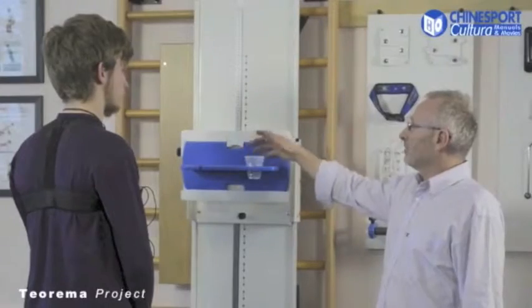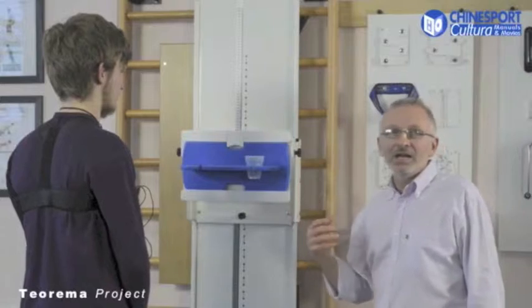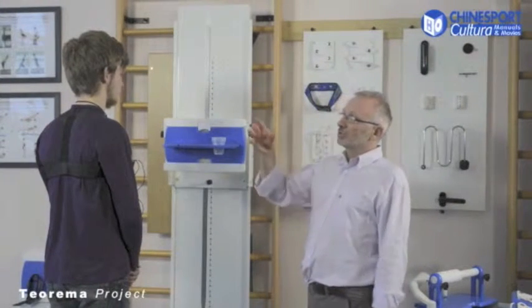What we would like to insist on and focus attention on in relation to the therapist's role is paying more attention to the manner in which the movement is completed. Therefore, we must pay attention to the quality of the movement, observation, correct positioning, and the scapula in relation to the chest, the correct movement of the scapula, correct stabilization of the trunk, or the task of extending the trunk.